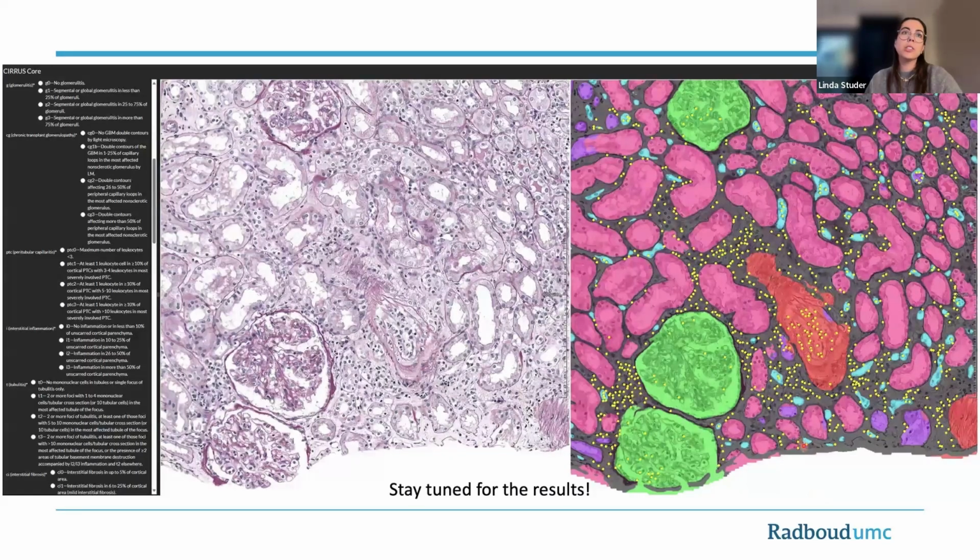We also see it sometimes because, though it's not on here now, we also have the class empty glomerulus, which is literally an empty glomerulus. So you have really white space like that, and that needs to be correctly detected as such. And then sometimes you have large dilated vessels that also have a lot of white space in them, and it really depends. I would like it if somebody worked in the future on the tissue segmentation. I think a multi-resolution approach could be really nice, because some structures are really easy to recognize at low magnification, and for some you really need to zoom in.